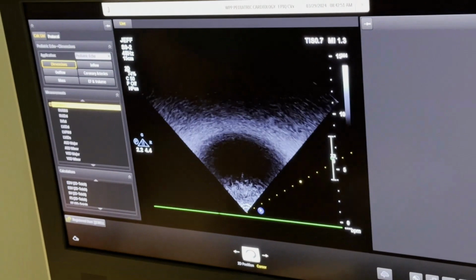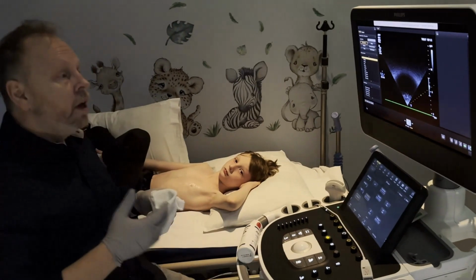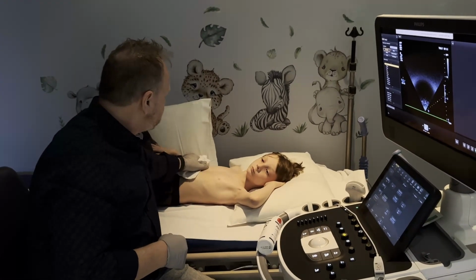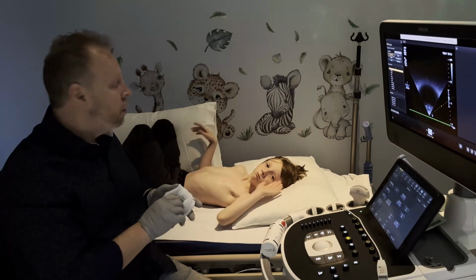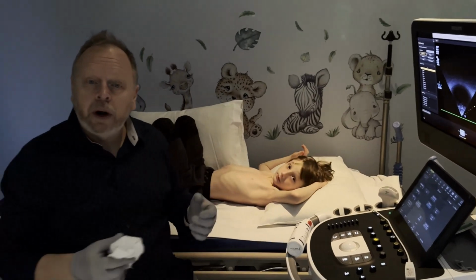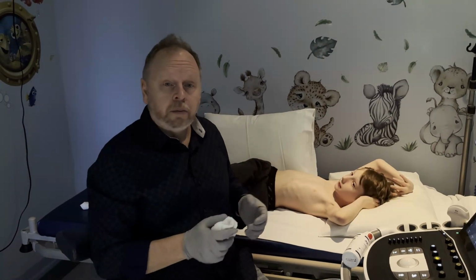So that's really about it as far as coronaries. Those are the views that you can see it. You can go high into the suprasternal region and kind of come back down into a high parasternal short axis view. Sometimes that'll bring in the coronaries a little bit better. We were kind of doing that when we were down there. We were sliding up instead of sliding down. It's all personal preference.